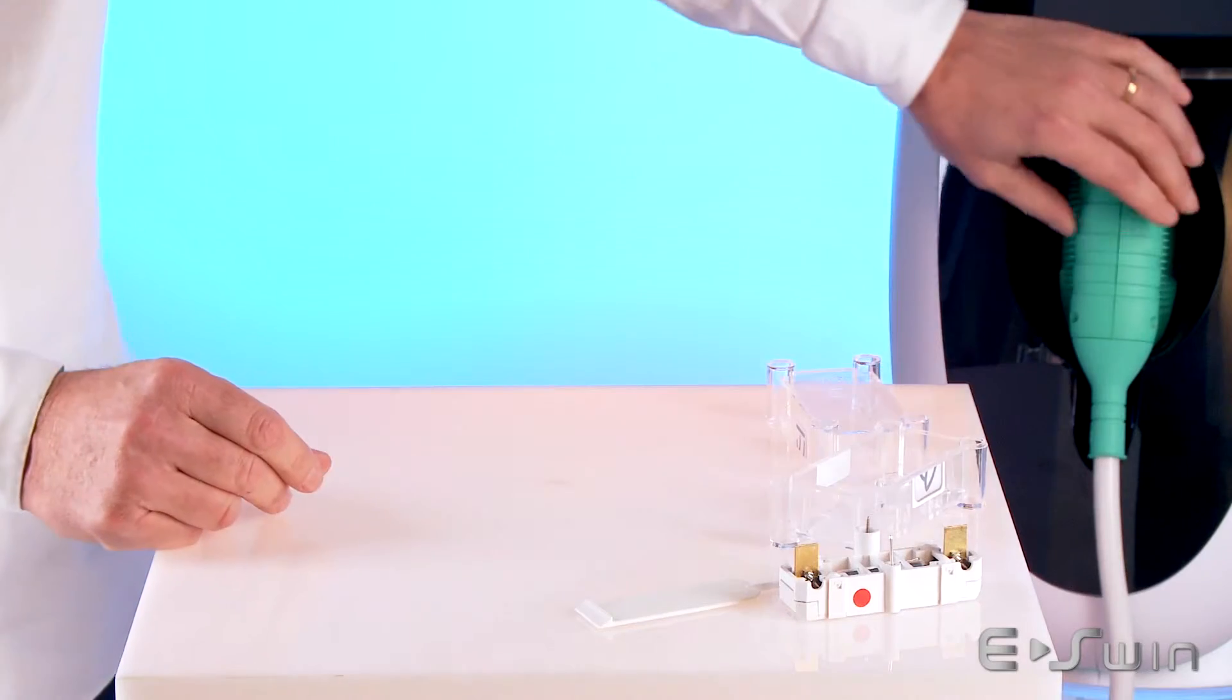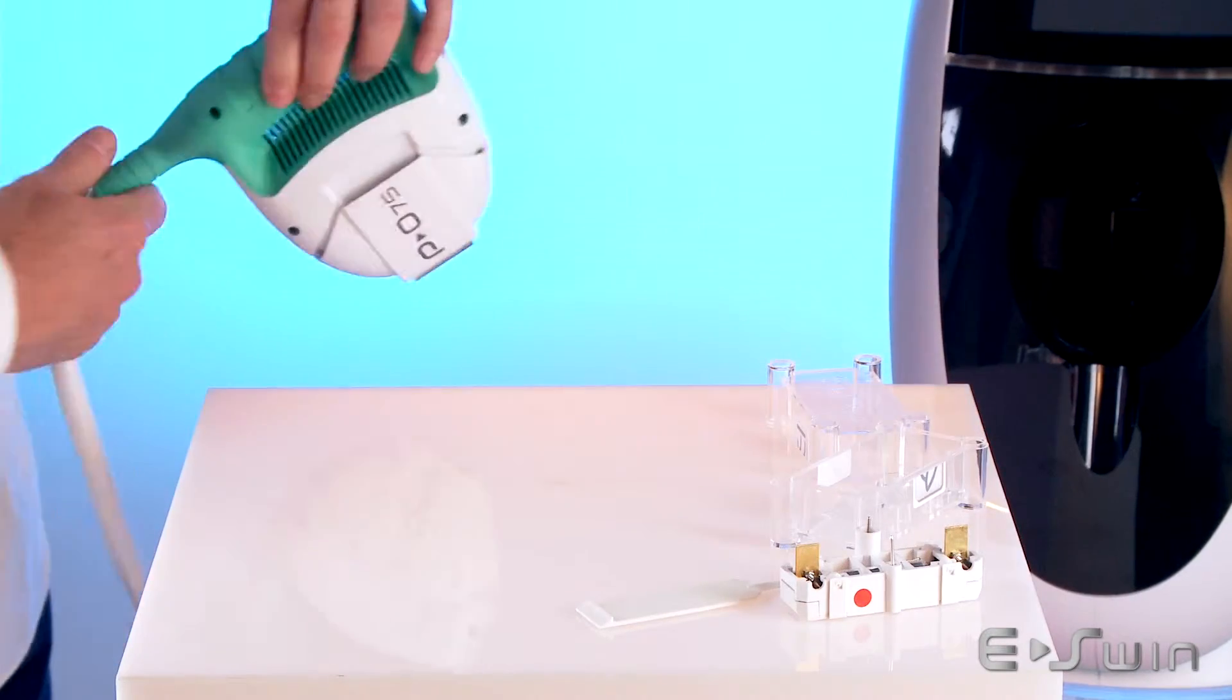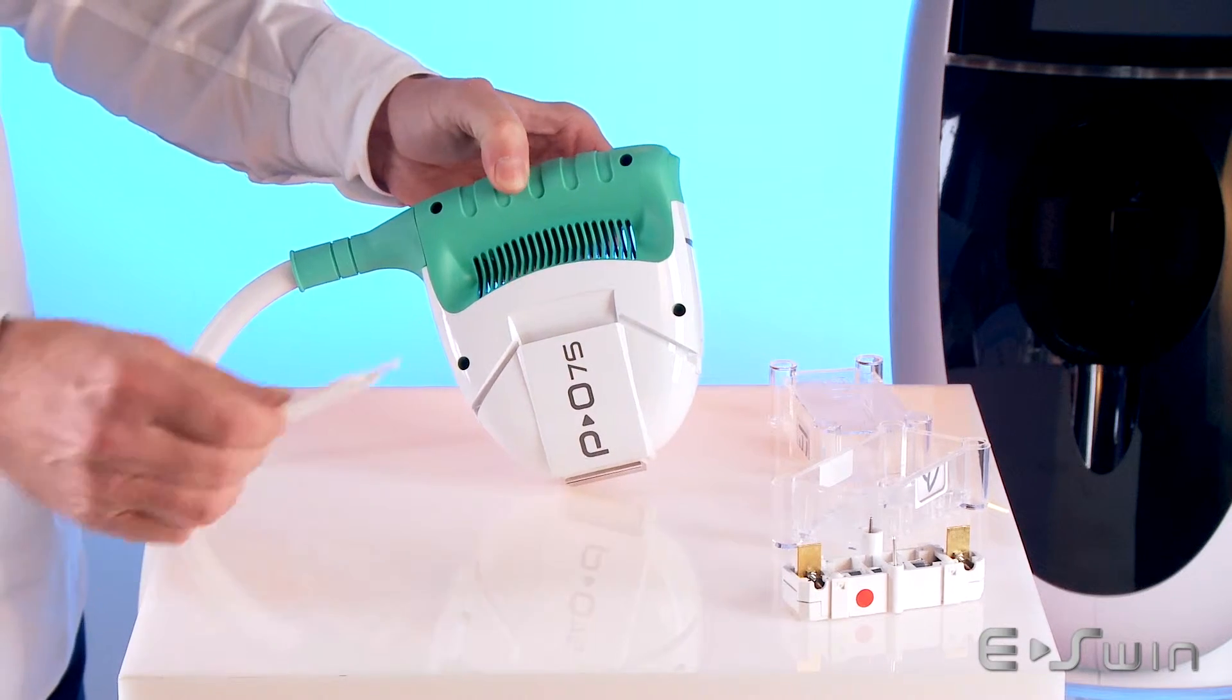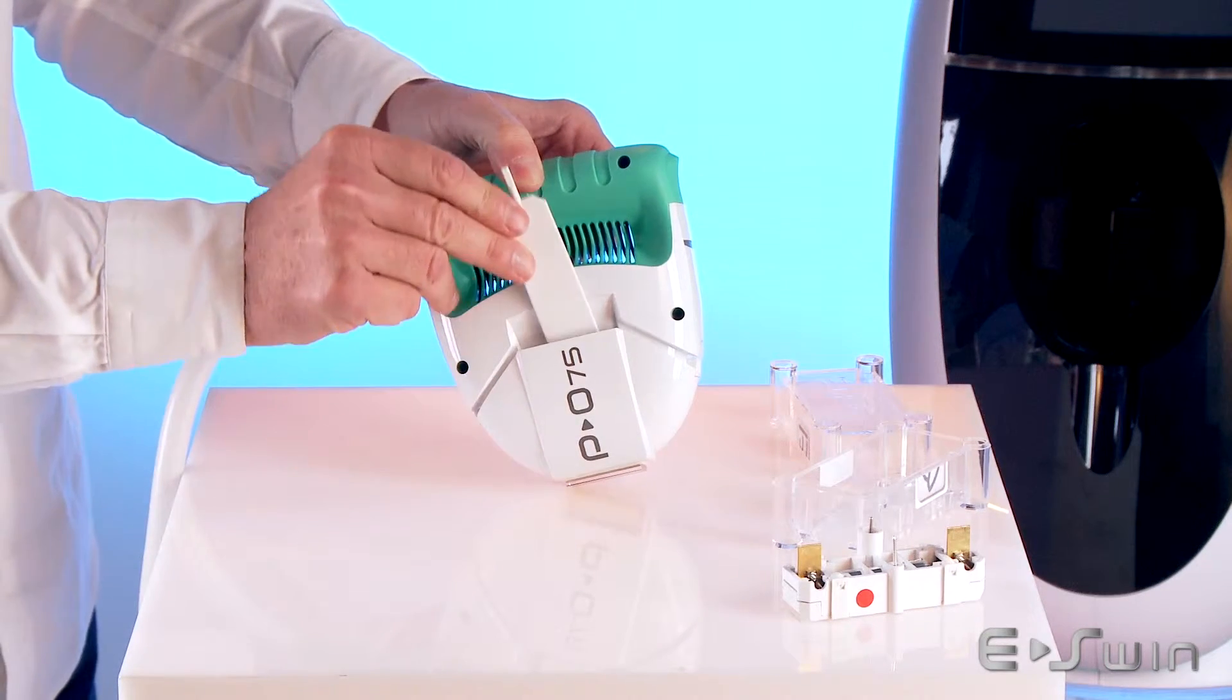Now take the applicator as shown on screen. Push the cartridge extractor all the way into the mobile head.